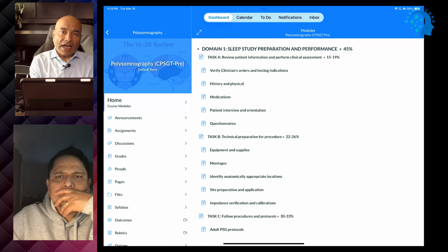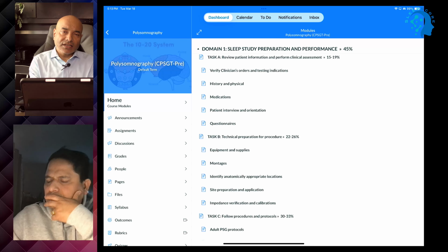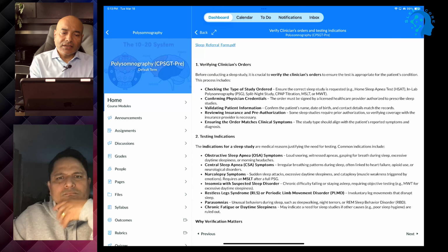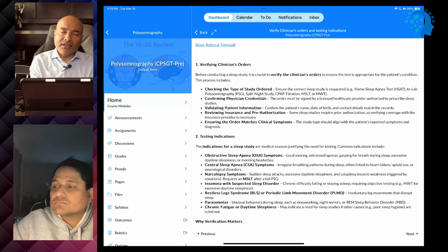There are different kinds of sleep study. One is the standard sleep study. Number 2, titration. Okay, let's open verifying clinician's order.